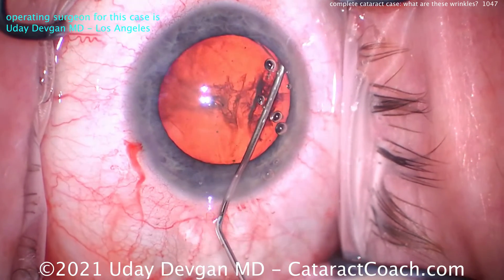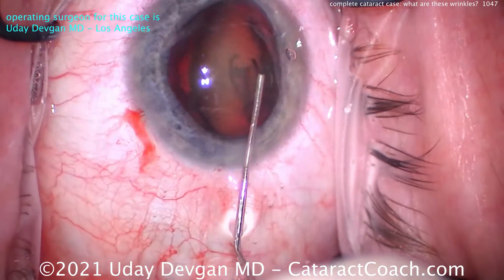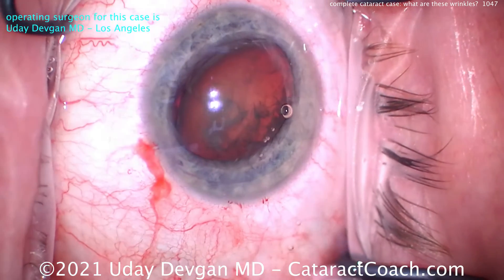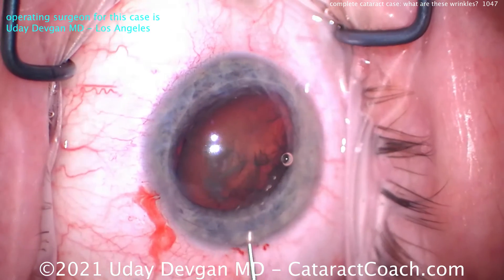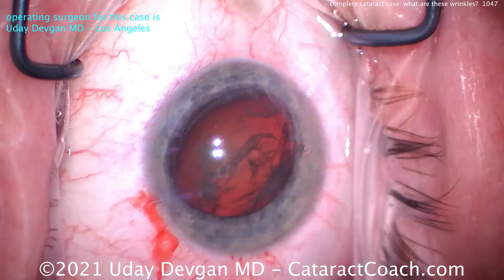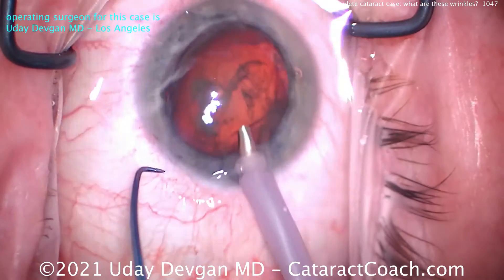There's a good wave, another good wave — I like that. The nucleus edge comes up. Hey, if it comes up, I'll take it. You can see the side of that nucleus — the equator. This lens has a reasonable amount of nuclear density. Remember, the red reflex in my videos is extra strong to make for enjoyable viewing, but it's not normally like that in a microscope view.